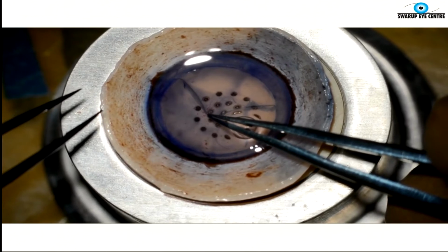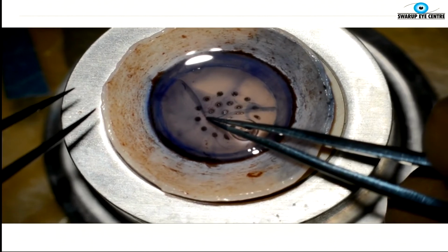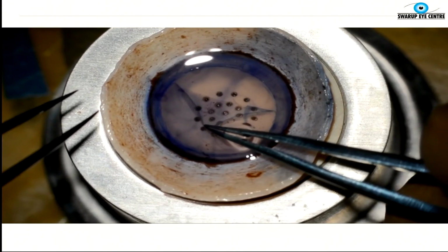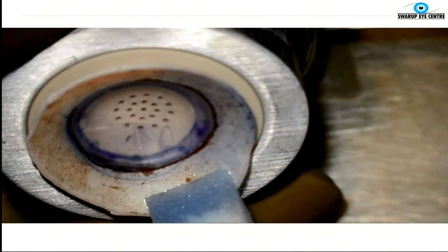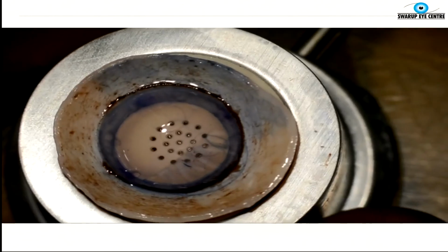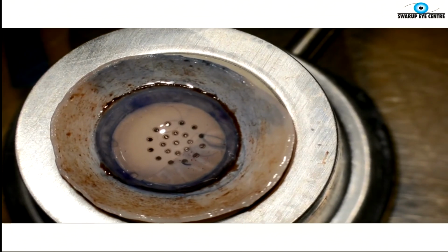Or you could use the little dissector and gradually try to separate that from the other side. So you can see I'm doing this very tentatively, gradually, as I'm watching this edge, slowly strip. You shouldn't strip the whole thing. About 2/3 is what you need to strip. And once you've stripped about 2/3, you can just make it lie down, and you have to stain this part so that you can identify the stripped from the unstripped area. That's what we're going to be doing.